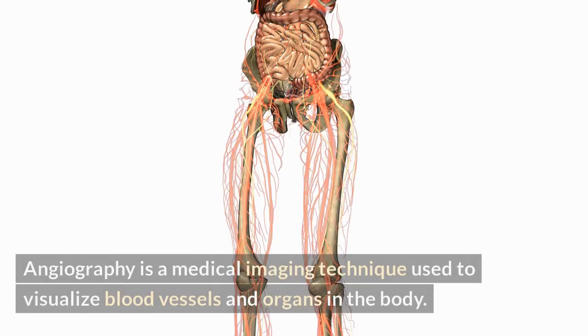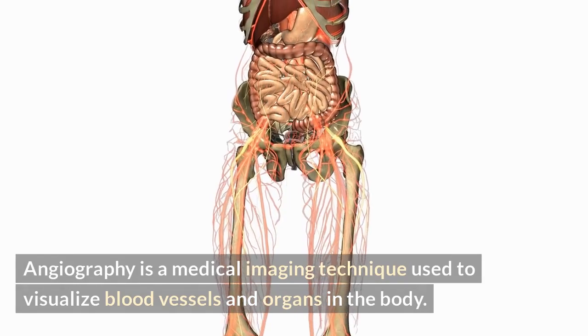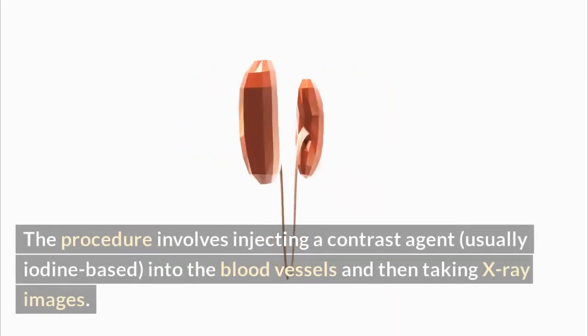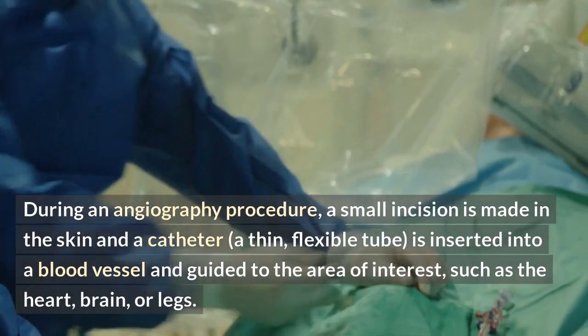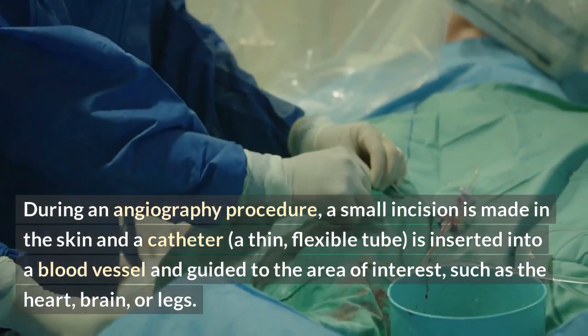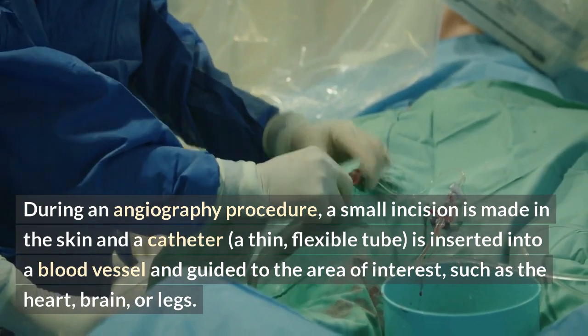Angiography. Angiography is a medical imaging technique used to visualize blood vessels and organs in the body. The procedure involves injecting a contrast agent, usually iodine-based, into the blood vessels and then taking X-ray images. During an angiography procedure, a small incision is made in the skin and a catheter, a thin, flexible tube, is inserted into a blood vessel and guided to the area of interest, such as the heart, brain, or legs.